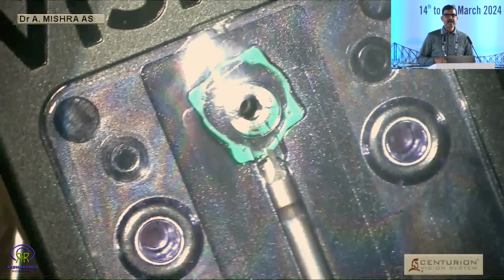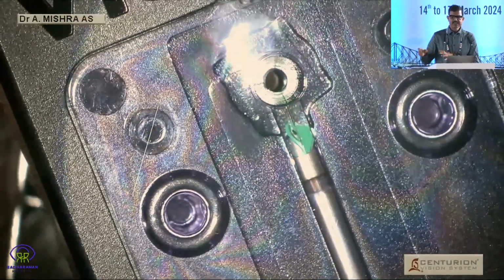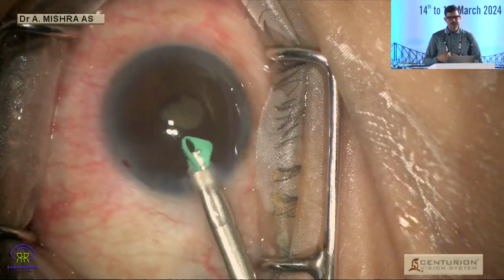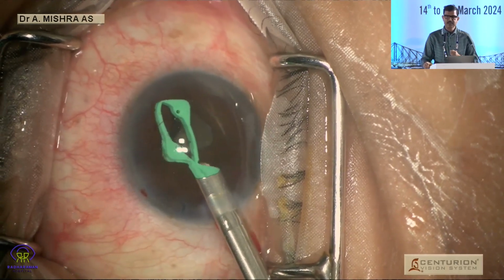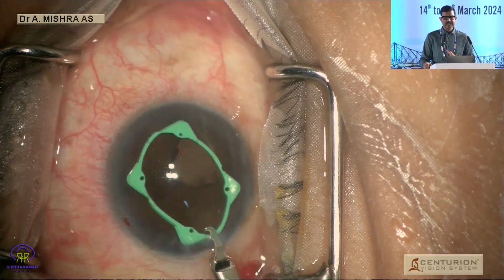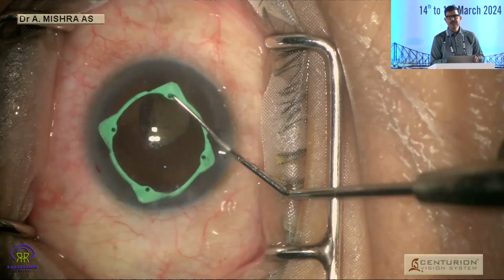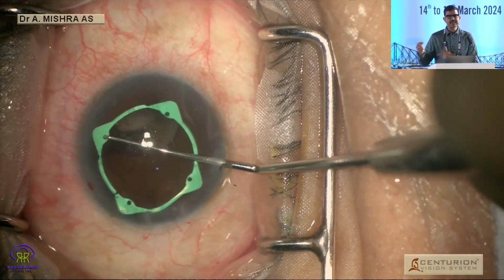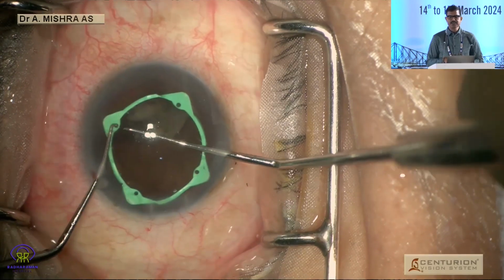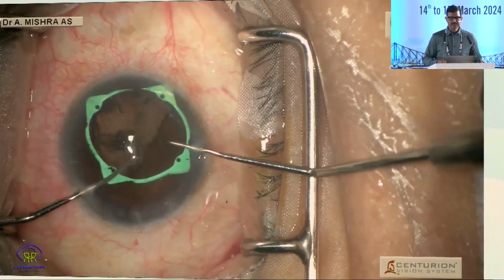This is the Visitec eye ring, which has come up recently, and the material here is polyurethane, which is a much softer material. Just like the Milligan, it needs to be pulled into the plunger first, and then it has to be delivered into the anterior chamber. And then after it is delivered into the anterior chamber, one by one, all the angles can be engaged. The advantage that I found with this is that it maintains a more circular pupil than the other devices. So the shape of the pupil is more circular, and after its removal also the pupil somehow maintains its circularity.